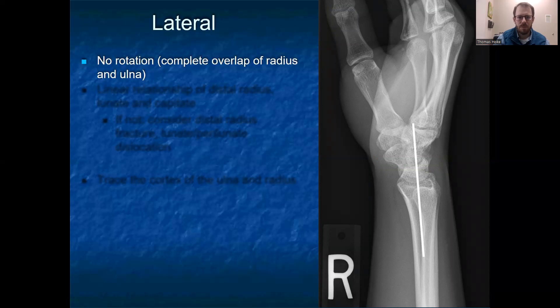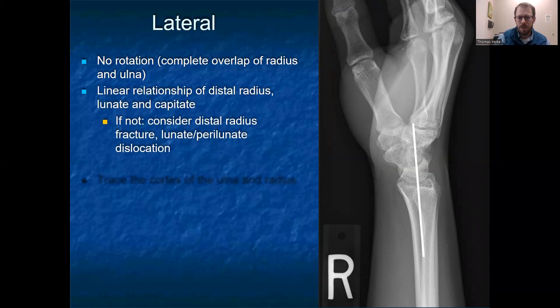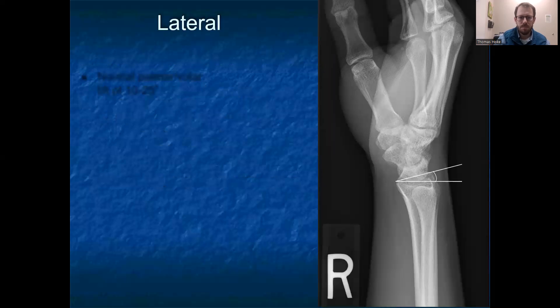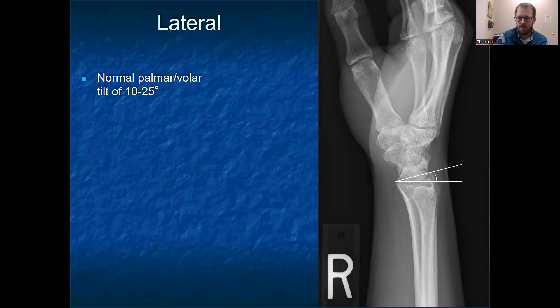Moving on to the lateral view: you should have no rotation, meaning the ulna and radius are completely overlapping. There should be a linear relationship of the distal radius to the lunate to the capitate. If not, consider either a distal radius fracture or a lunate or perilunate dislocation — lunate dislocation being a dislocation of the lunate from the distal radius, and perilunate being the capitate from the lunate more distally. Trace the cortex of the ulna and radius for subtle fractures. You can also assess the normal palmar or volar tilt of the distal radius, which should be 10 to 25 degrees.